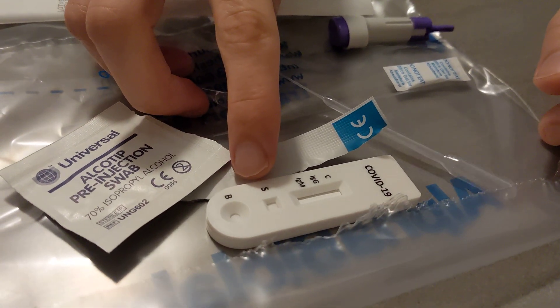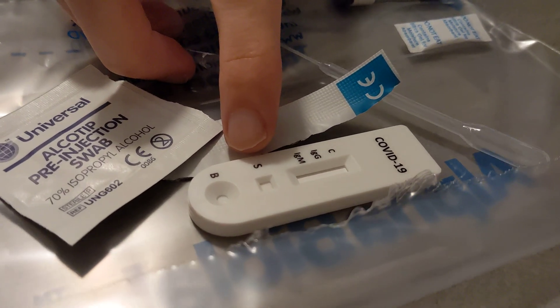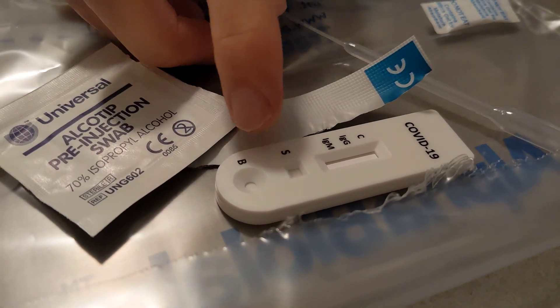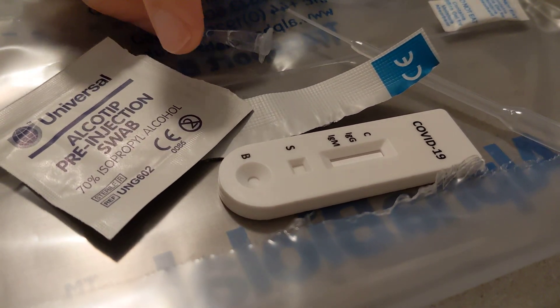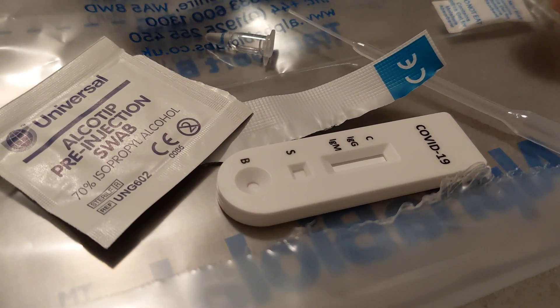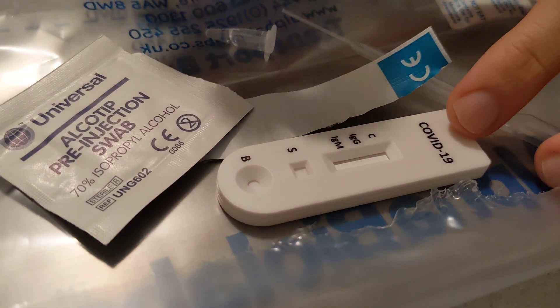As little as two droplets of blood are needed, so it's not going to hurt or anything. After that, you're going to have to wait up to about 20 minutes or so to get your result.